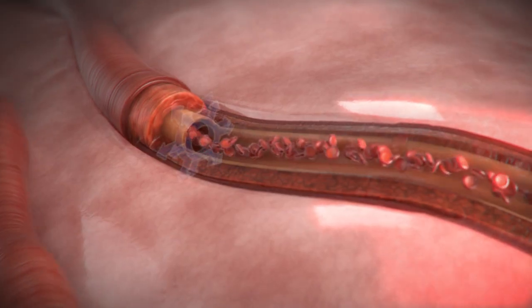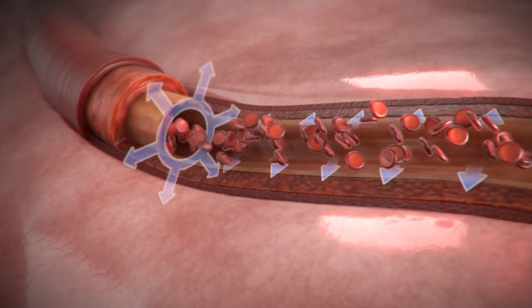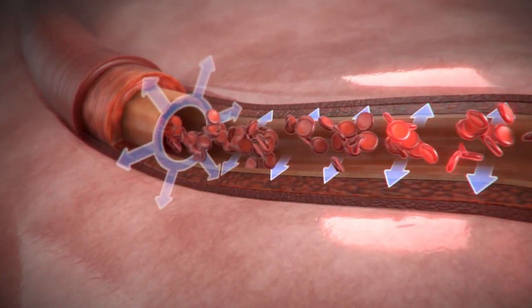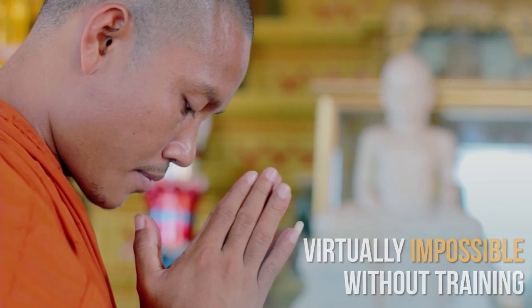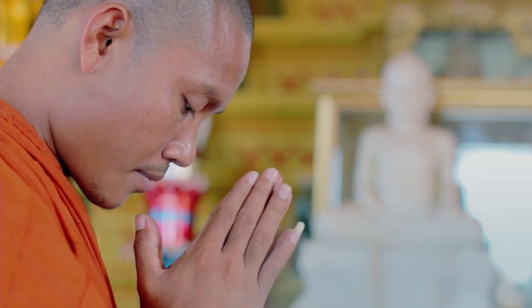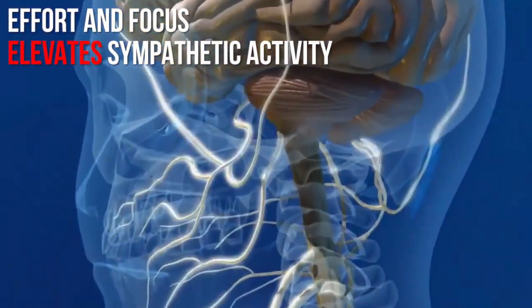Now, the critical point here is prolonged exhalation without conscious effort. It's during the prolonged exhalation that elevated sympathetic activity is reduced and blood vessels relax. Now, breathing this way on your own is virtually impossible unless you're a trained yogic monk. And even monks use effort and focus to prolong exhalation, which is actually counterproductive as it elevates sympathetic activity.